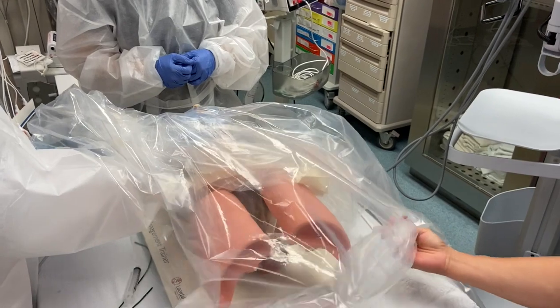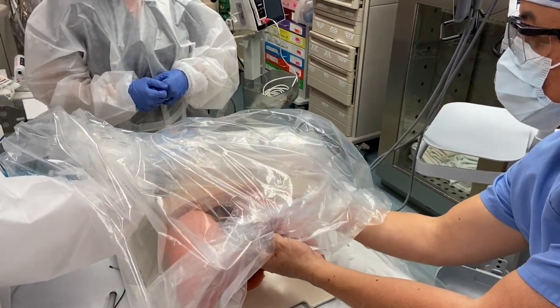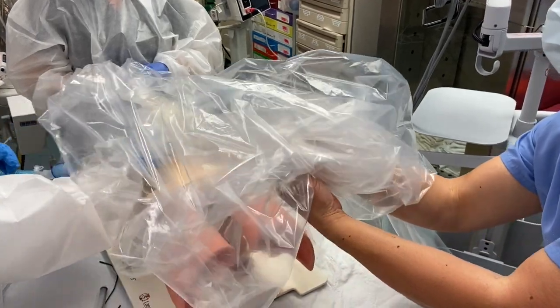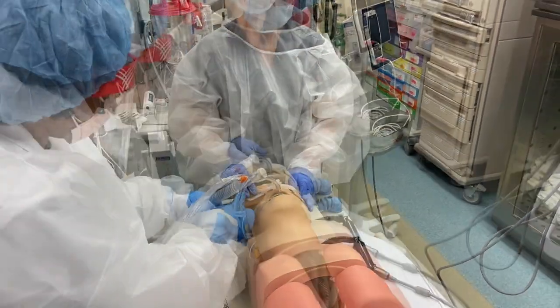A nurse or assistant would then roll from the other side and the drape would be removed. The nurse or assistant would of course be wearing proper PPE, not demonstrated here in this video. The tube would then be secured in place.